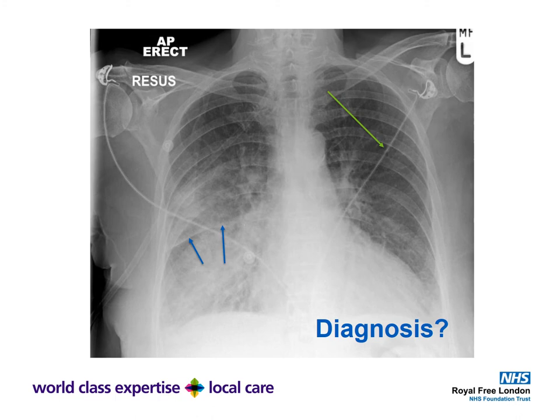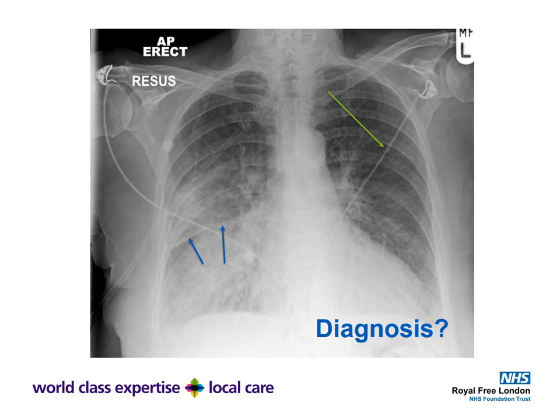What's the diagnosis? This looks like a bilateral batwing appearance. The two blue arrows point to fluid in the horizontal fissure. The heart appears enlarged, even allowing for an AP projection. This is probably acute or congestive cardiac failure. The green arrow draws attention to an ECG lead going up to the left shoulder — it's important to point out such artifacts in an exam, as they can be clinically significant, such as a misplaced central line.